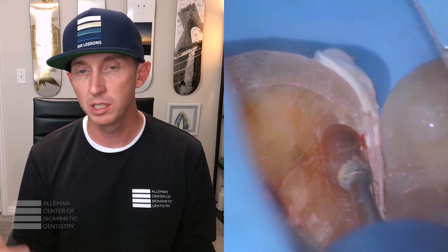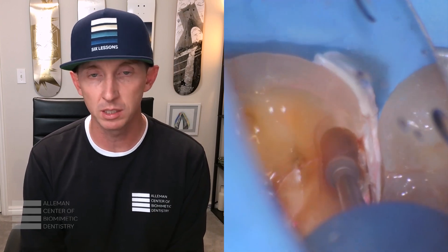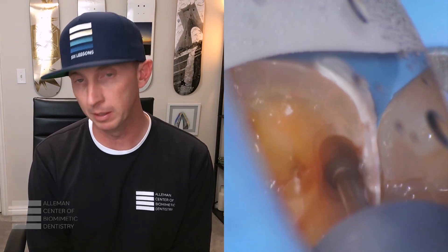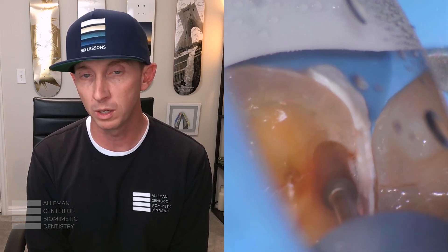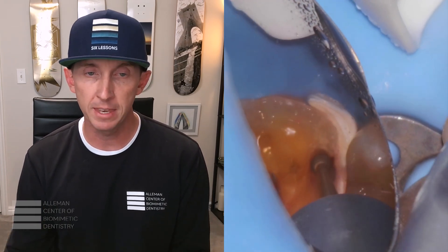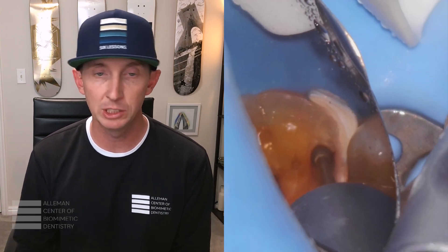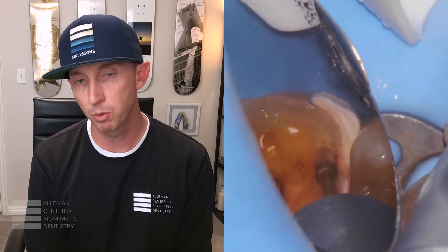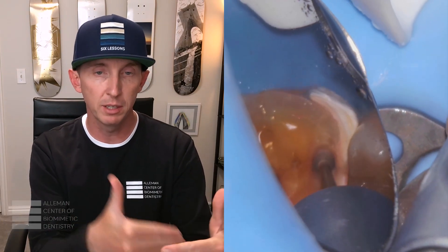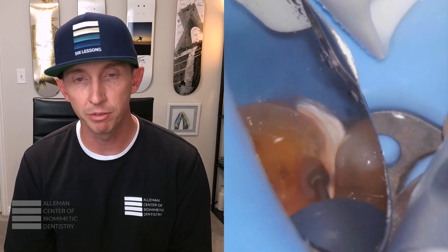Now this fracture is still present at a depth of eight millimeters. This is a point where most dentists feel very uncomfortable going another one or two millimeters more, for fear of not being able to eventually restore this type of defect. So I want to focus on the isolation — using Teflon tape along with your rubber dam helps create a clear vision and a clear field for the peripheral seal zone that we're treating and removing the fracture from.